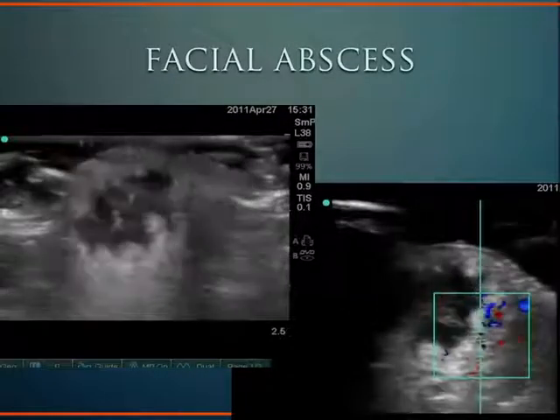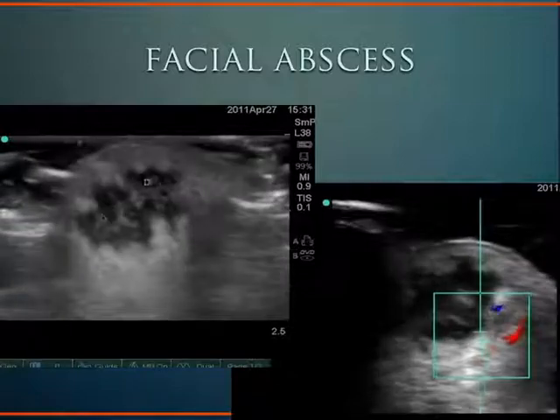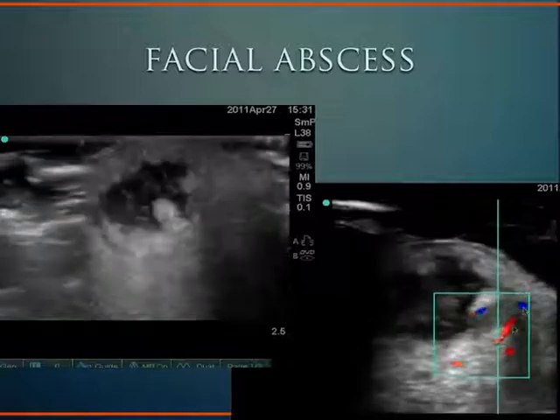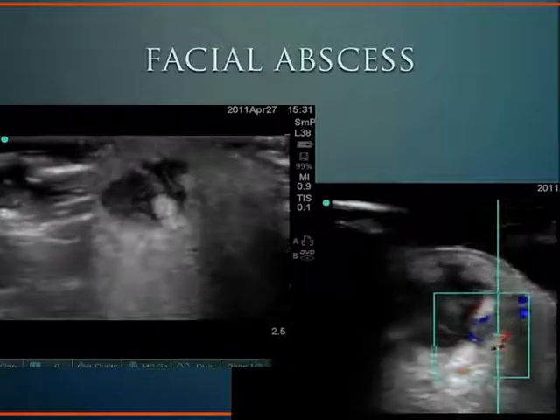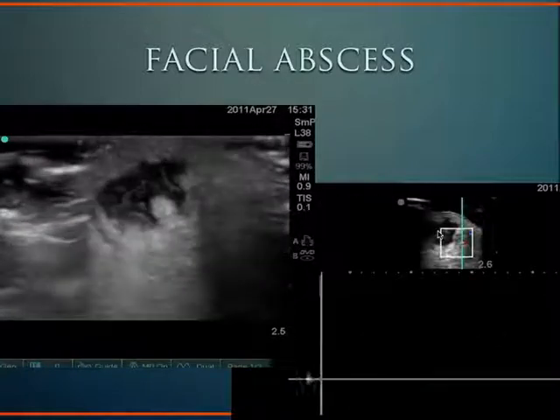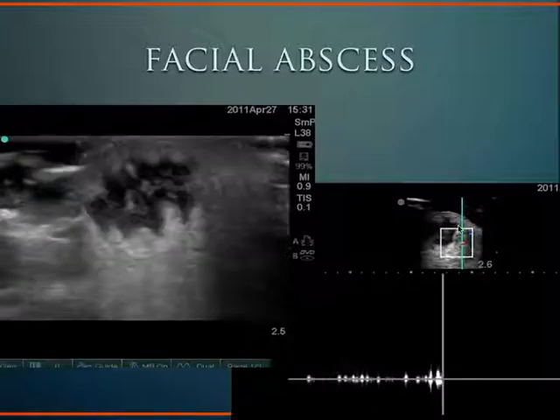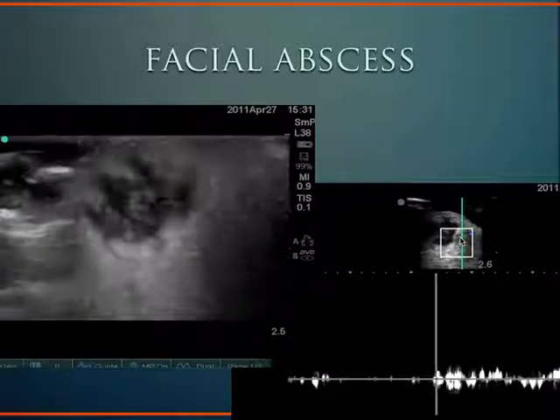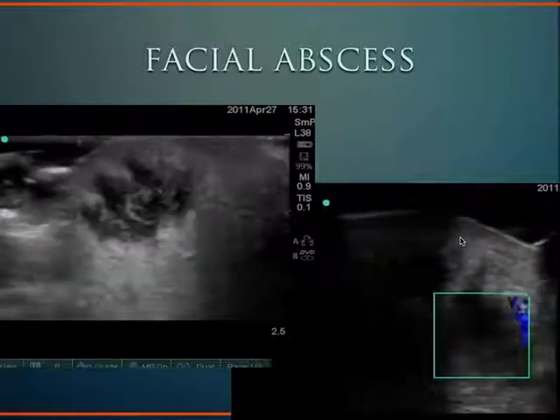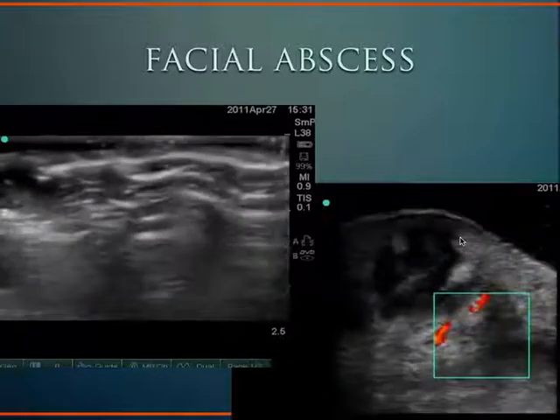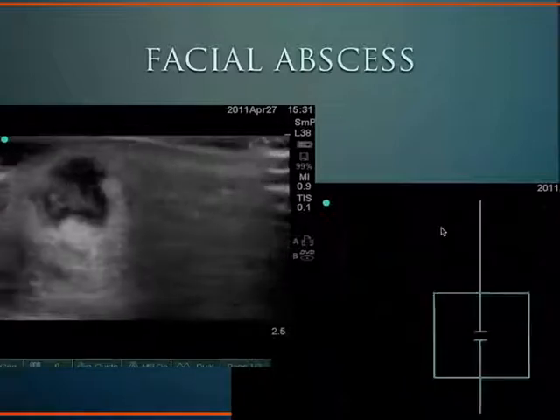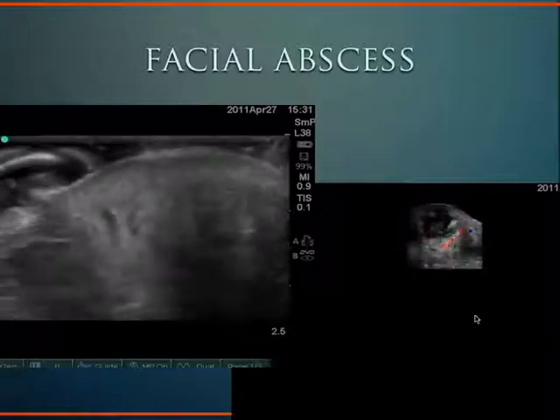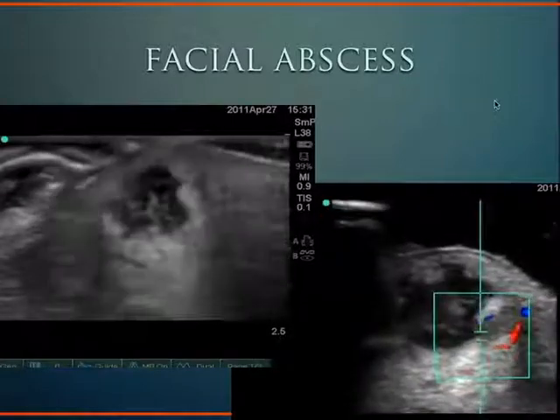Here's another example of where we can use ultrasound on the face. This is a facial abscess — we see this hypoechoic debris here. This ultrasound demonstrates how close the facial artery is to this abscess. One of the things we worry about when we drain an abscess is accidentally striking an artery, so ultrasound helps guide into the abscess and away from vascular structures such as the facial artery seen here.